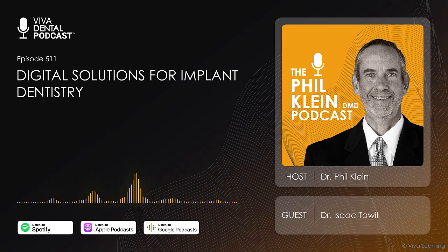But the reality is, if you could just unscrew a healing cap and simply capture with the magic wand, I like to call it a Harry Potter wand when I talk to my patients, we literally can capture it like magic instantaneously and get all the little nooks and crannies that we want to capture. If we find an area that we didn't capture well, we can erase it and recapture that area. If we have half the arch, we can stitch it to the other half of the arch. It's really remarkable what we can actually get away with.